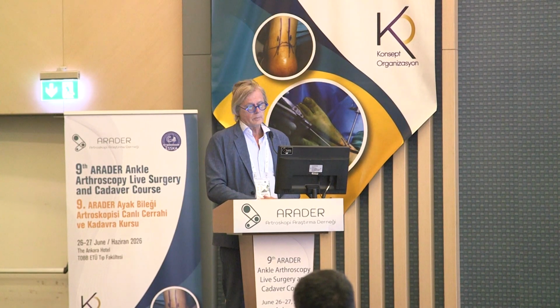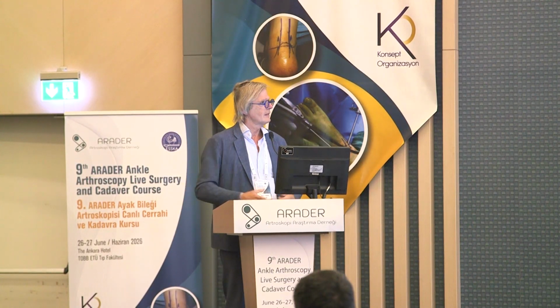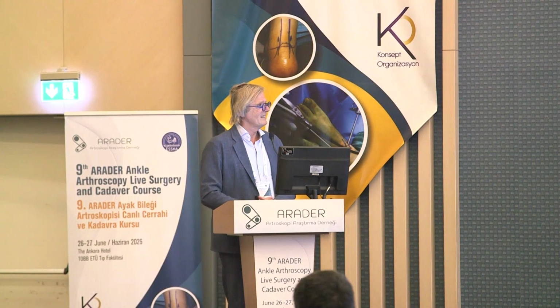Anesthesiologists don't like it so much because you have to turn the patient during the anesthesia, so you need a lot of man and woman power to do it, but yeah, you have to convince them that it's really important and that it's not an issue.